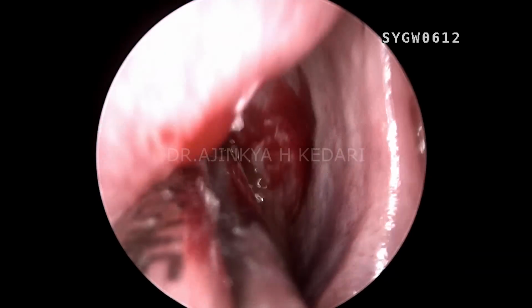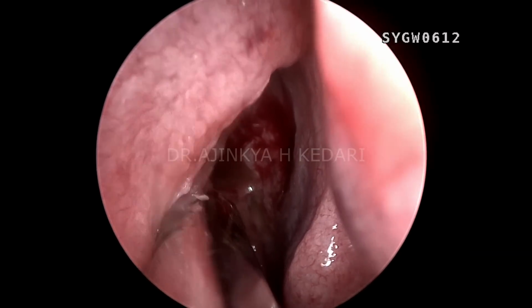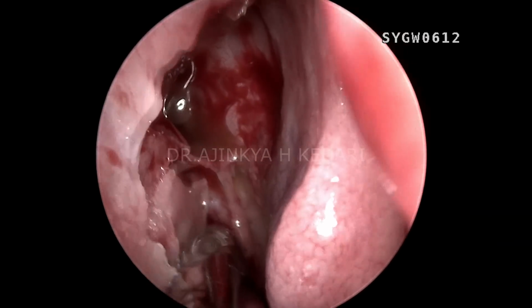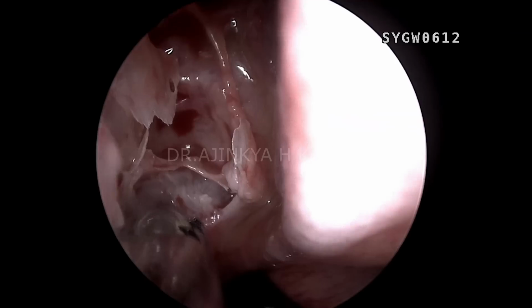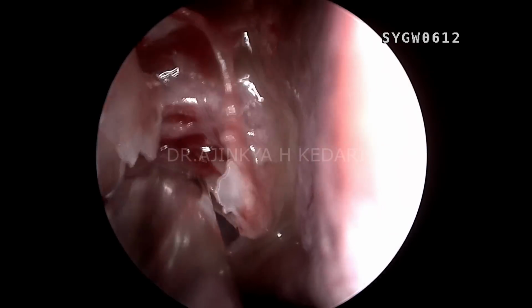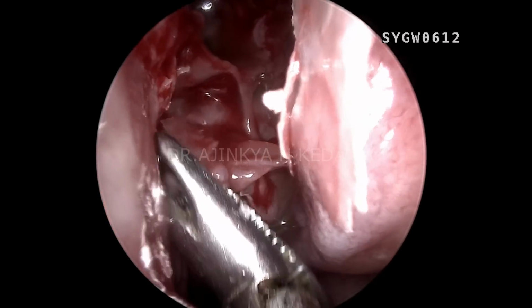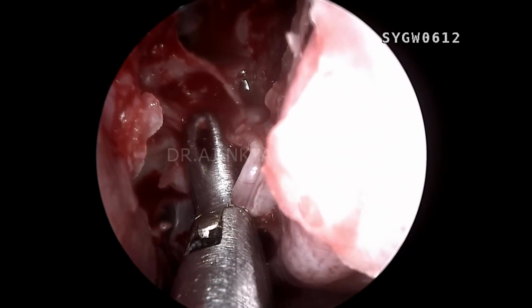Now I'm back onto the vertical uncinate process. The basic aim here is to have a wider opening to the middle meatal area. So far I have not taken away the middle turbinate. I have just performed a microfracturing on the middle turbinate so that it has become stabilized along the septum. You can see the middle turbinate is not moving at all. I have fractured it medially along the septum, and that is giving me a lot of space to walk in the middle meatus.